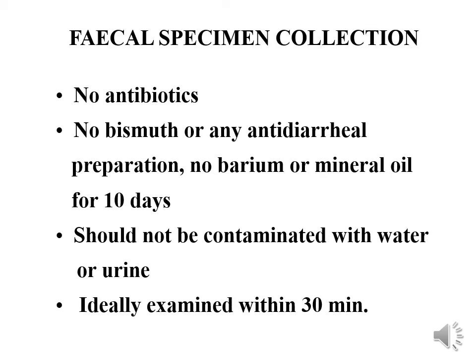In the laboratory, it is important to get well-collected specimens in clean containers which are well covered. So if you receive a specimen which is contaminated, for example, with water or urine, it is advisable to reject it and to request another specimen. And it is important to examine the stool as soon as it is in the laboratory. So ideally, the stool specimen should be examined within half an hour.